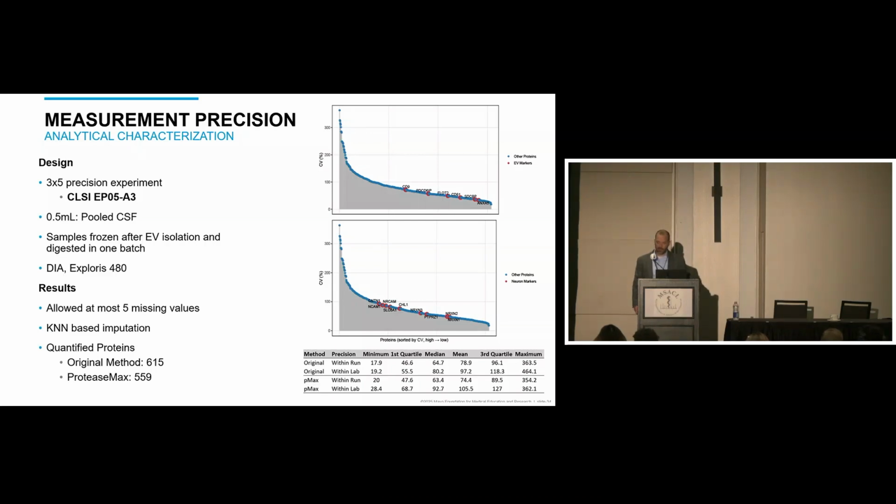So I think that, granted the median imprecision is a little bit higher, this is realistic, and it's still exciting. We know where we need to be to continue to move this forward. We can optimize the method, both pre-analytical and analytical. But I think we're still in a good position to find some potential novel markers.